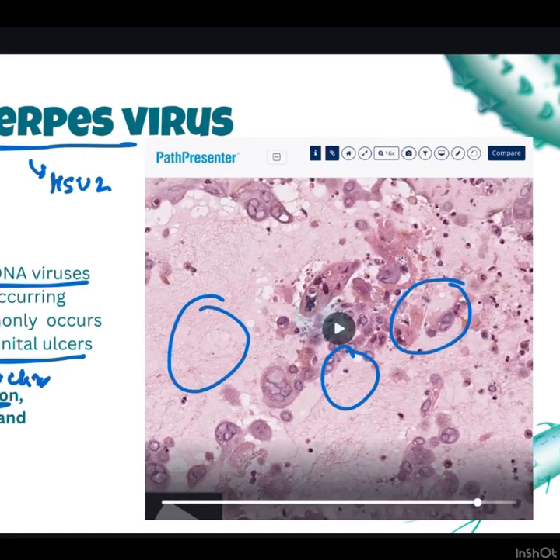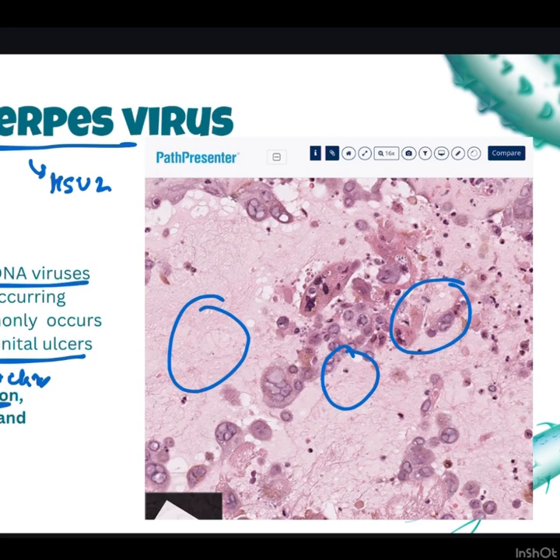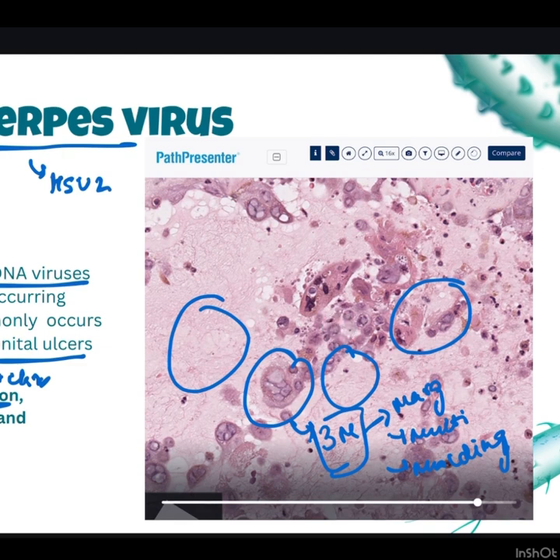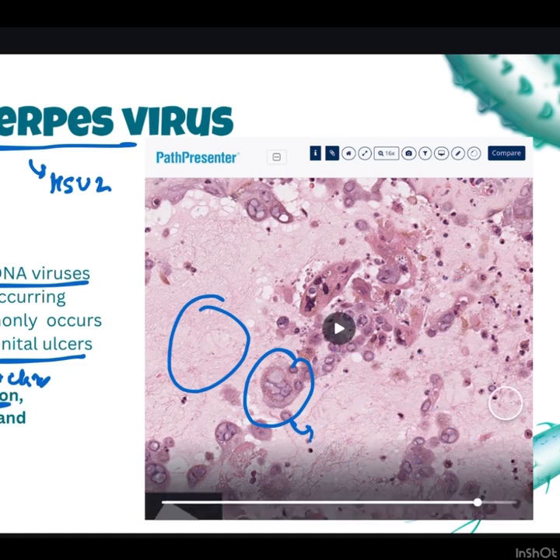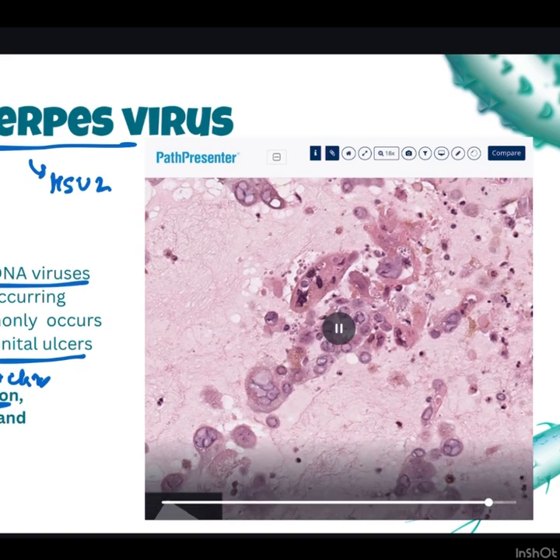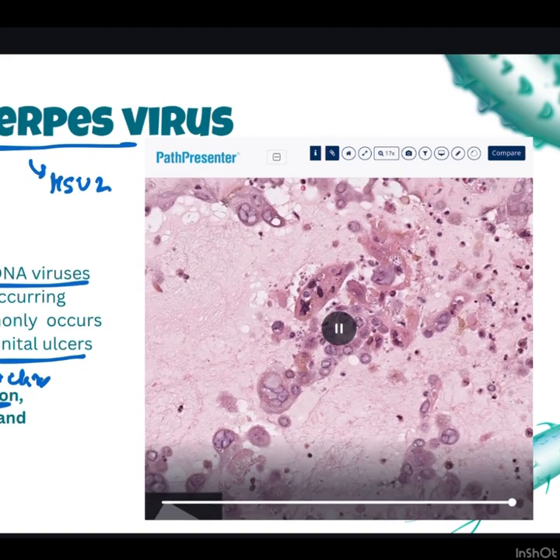All these are viral inclusions. There is another very beautiful viral inclusion showing all the three M's, which is chromatin margination, multinucleation, and molding. The reason why I keep repeating this is because these nuclear features are very, very characteristic of herpes virus, so that next time you will not be able to ignore these inclusions if ever you encounter them in your routine tissue section.